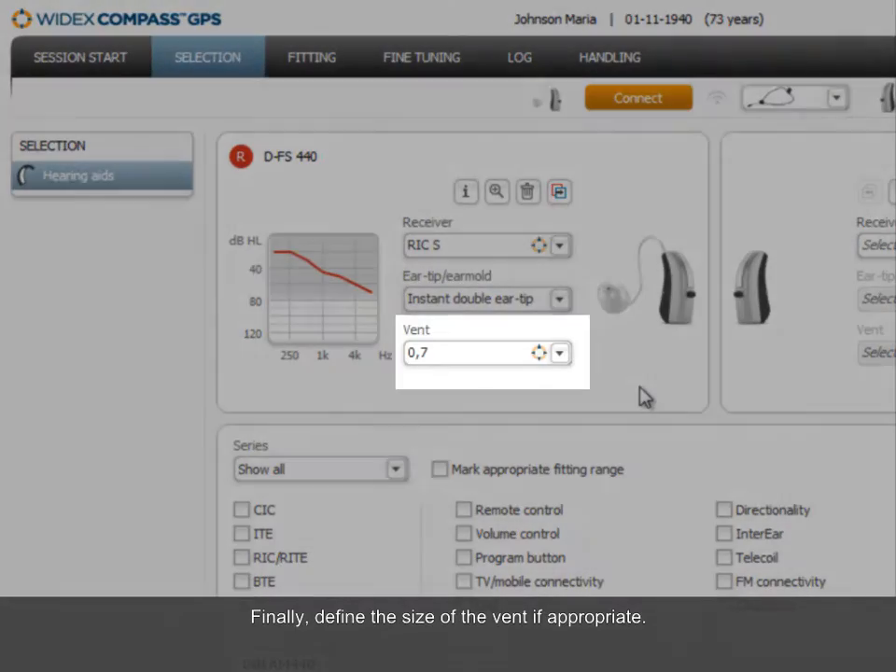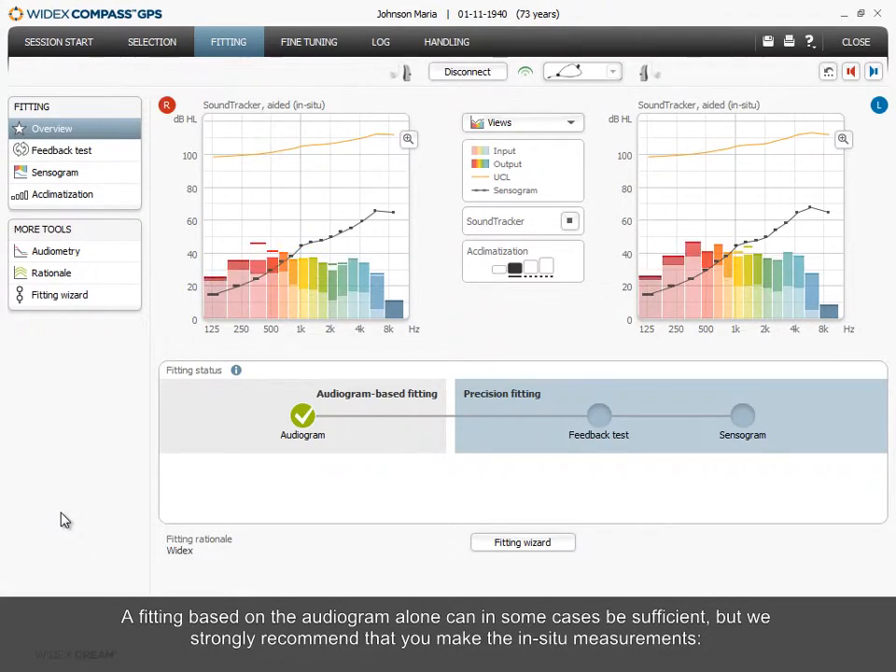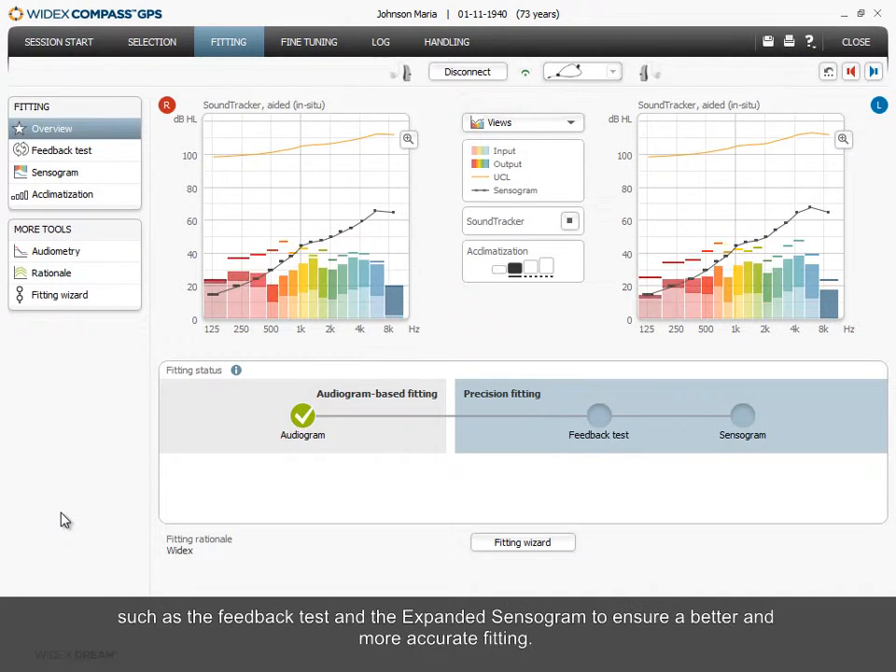Finally, define the size of the vent if appropriate. A fitting based on the audiogram alone can in some cases be sufficient, but we strongly recommend that you make the in-situ measurements, such as the feedback test and the expanded sensorgram, to ensure better and more accurate fitting.